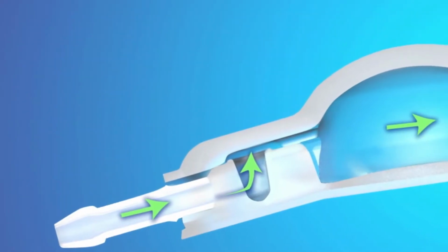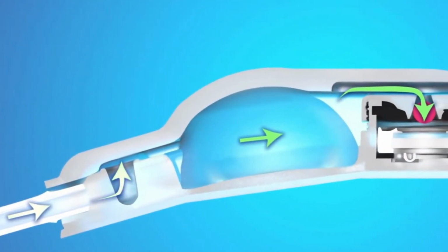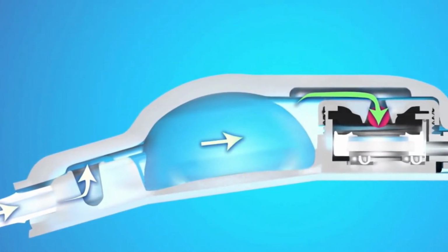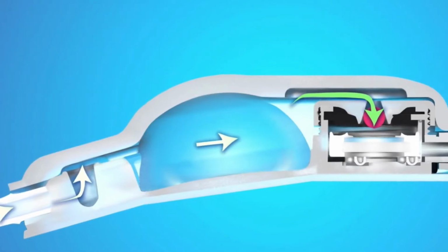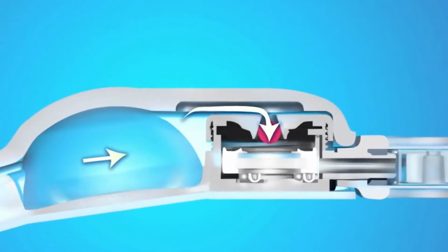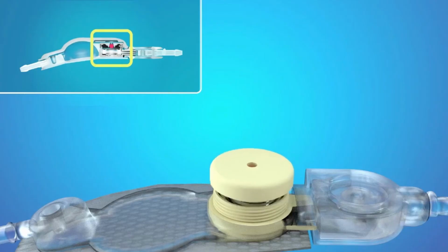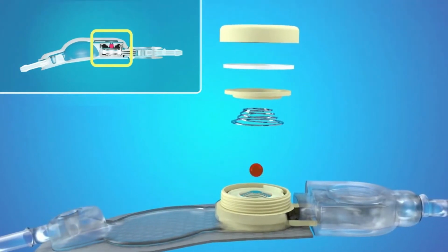As CSF flows through the Strata valve, it enters the inlet connector, flows by the proximal occluder, and into the central reservoir. For sampling CSF, the reservoir dome can be accessed using a 25 gauge or smaller non-coring needle. From the reservoir, the CSF flows into the cone opening of the adjustable valve mechanism. The valve mechanism consists of a ruby ball and circular spring design.